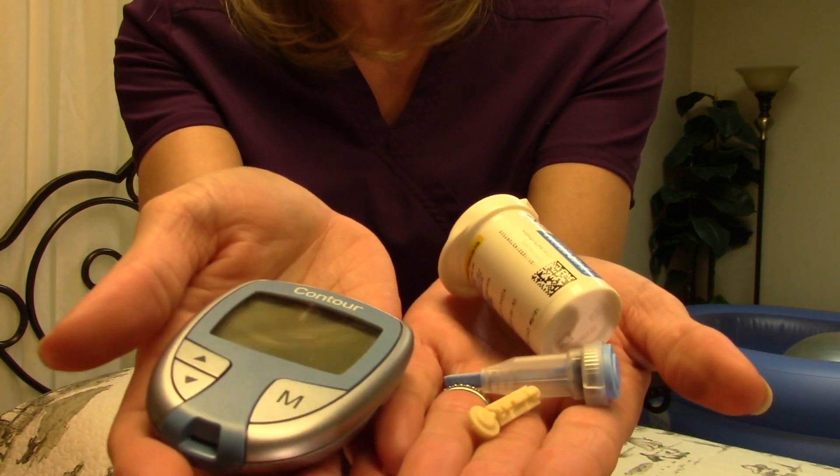Hey Mamas, it's your Cajun Stork here. Have you been told you need to be monitoring your glucose levels from home and now you have all of this stuff and you're not quite sure exactly what to do with it? Today's video is all the things you need to know about how to monitor your glucose levels at home, including a step-by-step demonstration. So keep watching.